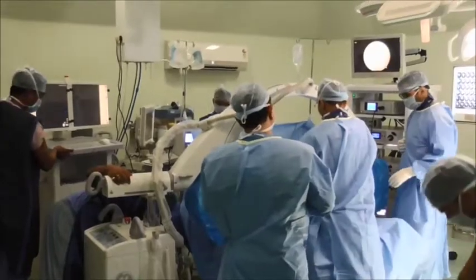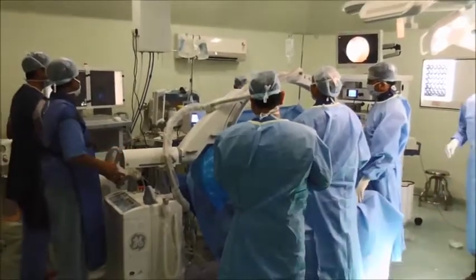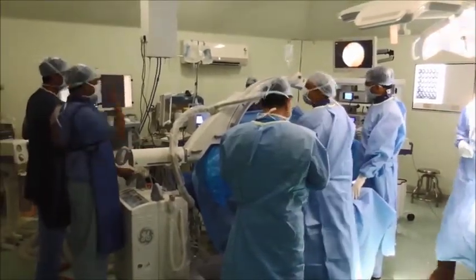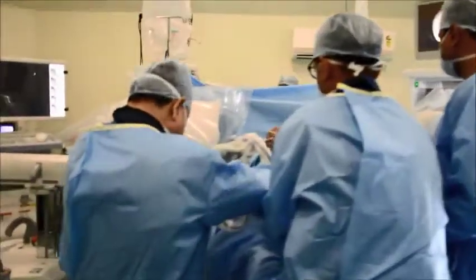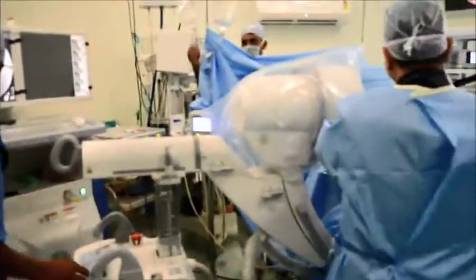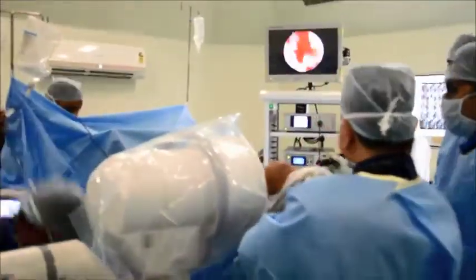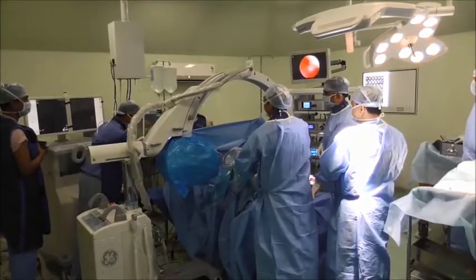For doing a right knee ACL reconstruction, the C-arm is brought from the right side in a horizontal or lateral position. Arthroscopic console is on the left side. C-arm can also be brought under the table as desired by the surgeon. We prefer it from the top of the table. The C-arm monitor is also on the right side.